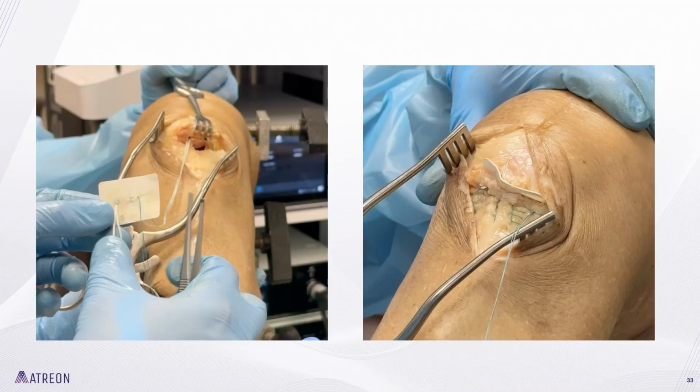So here's an example of how you would do that, which is what I'm doing now, which is adding anchors. It's open. Open surgery is pretty straightforward. So you slide it down, and then you complete your repair. This is a tension slide technique with whip stitches.